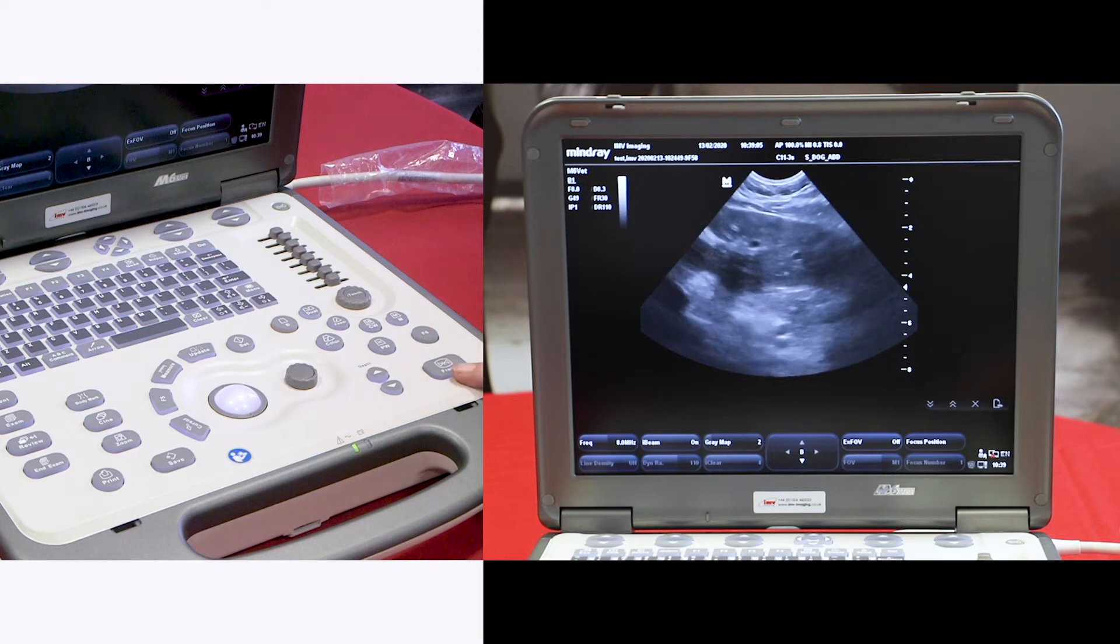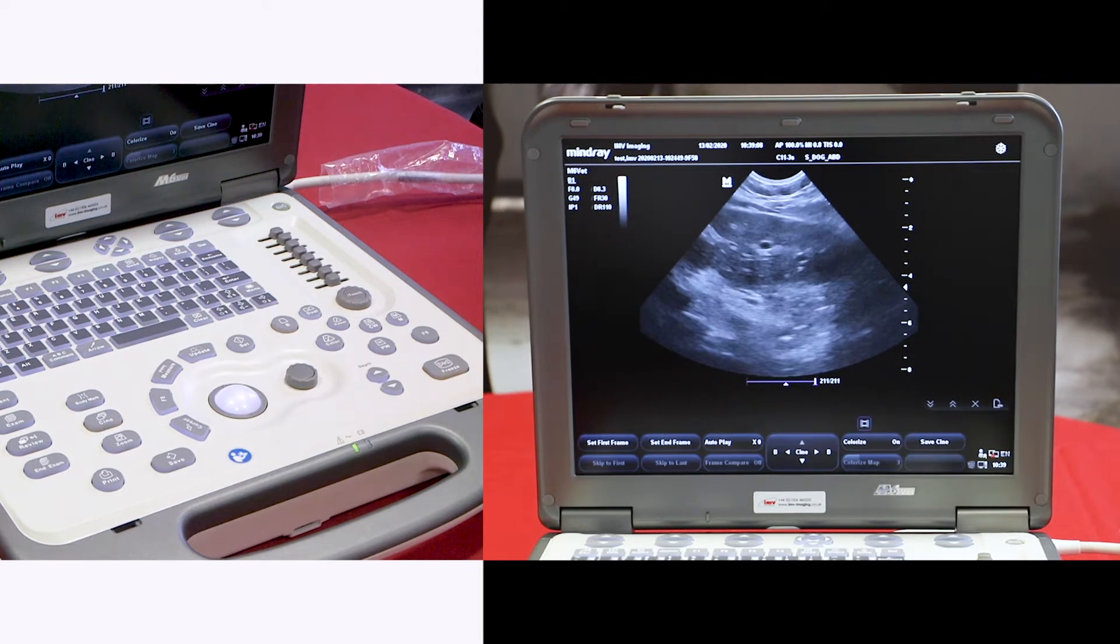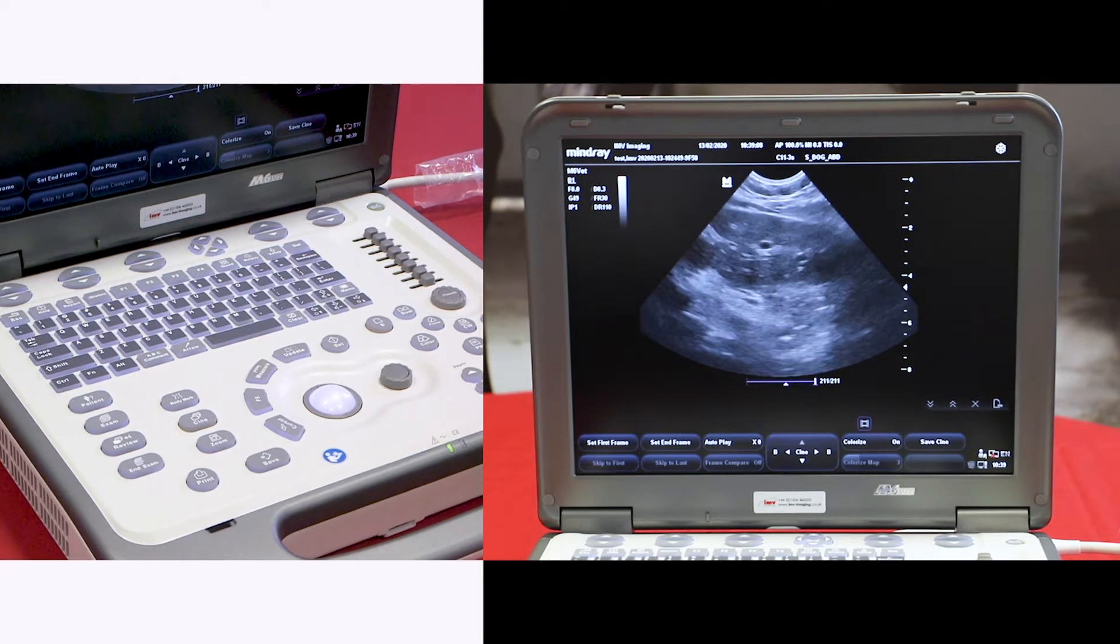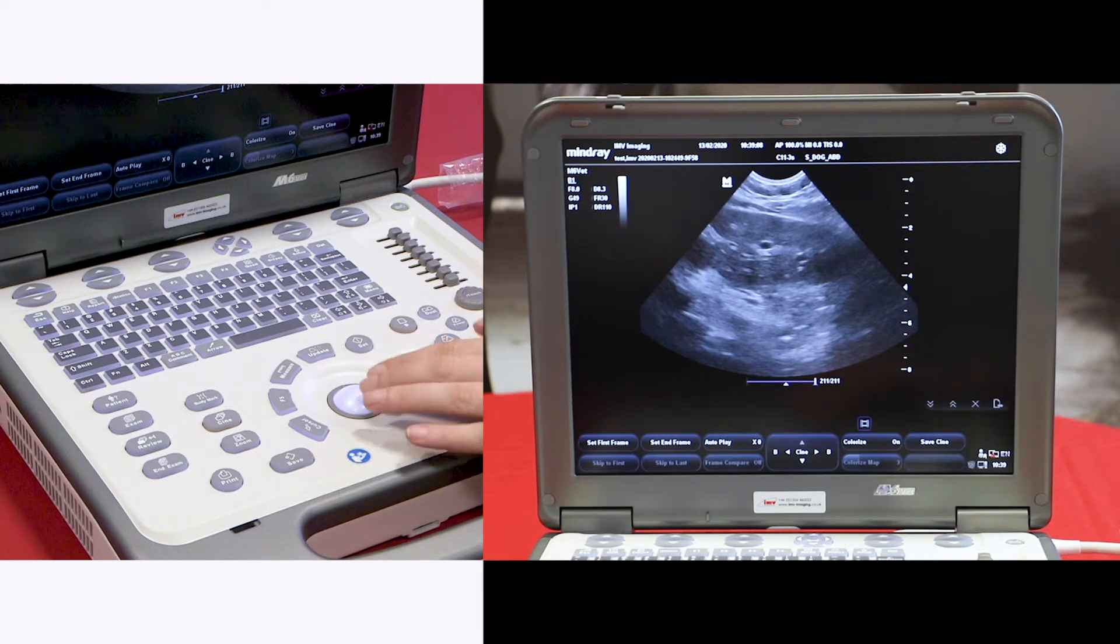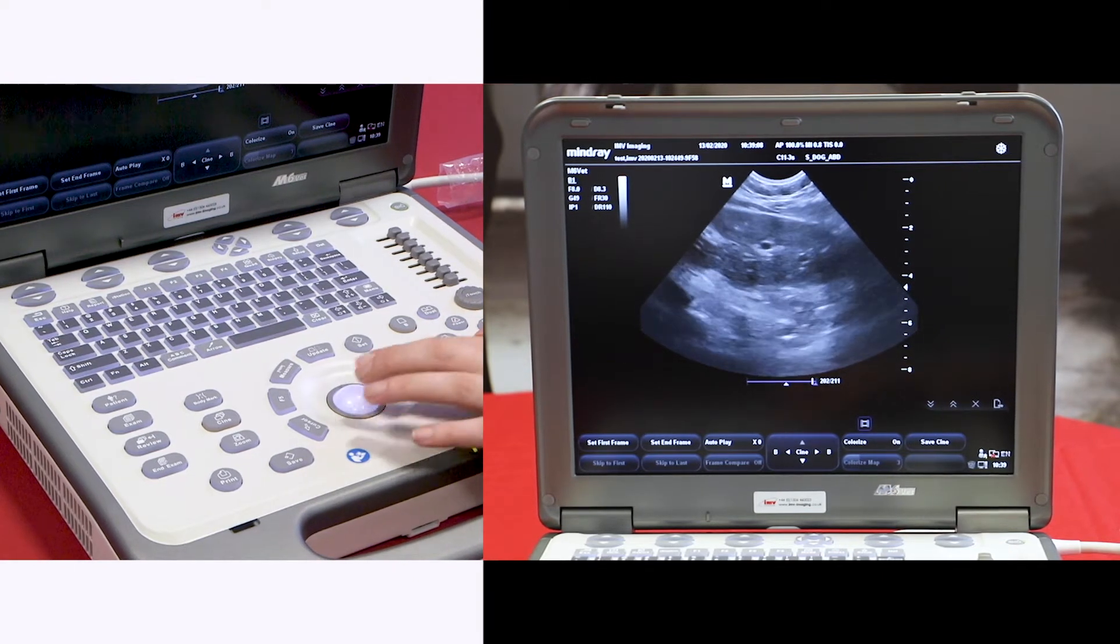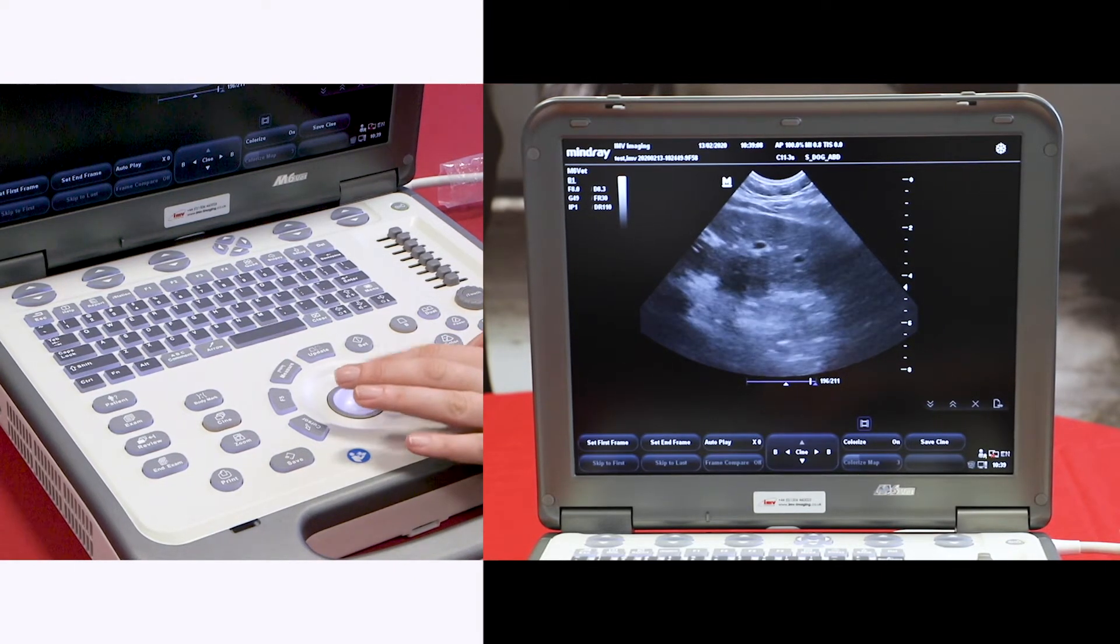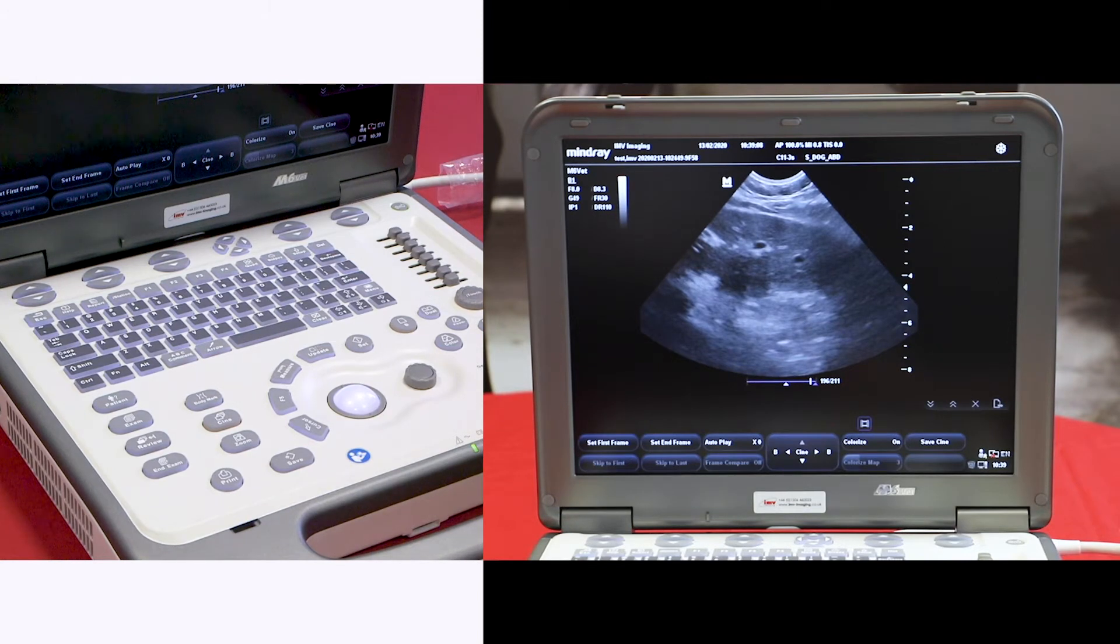To freeze an image, the freeze button is at the bottom right. If this isn't exactly where you'd like to take an image, you can scroll back with your trackball. At this point, you can add any annotations.